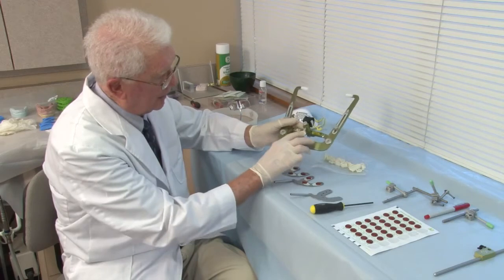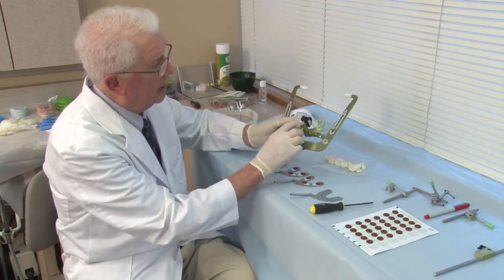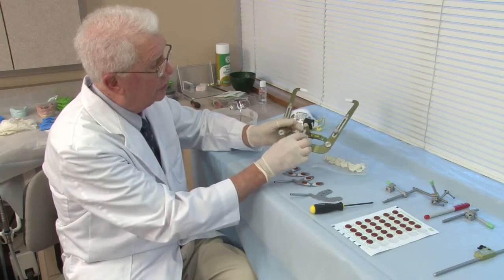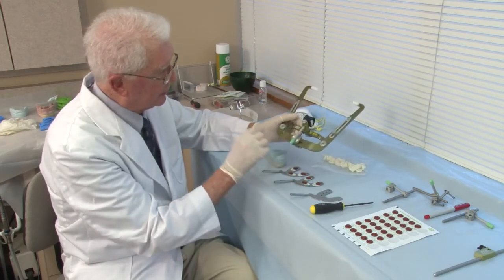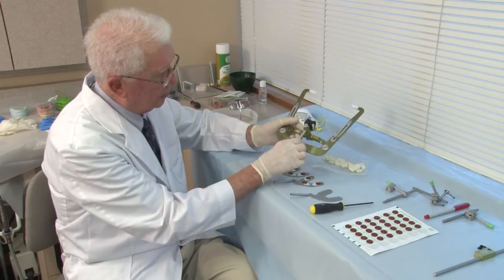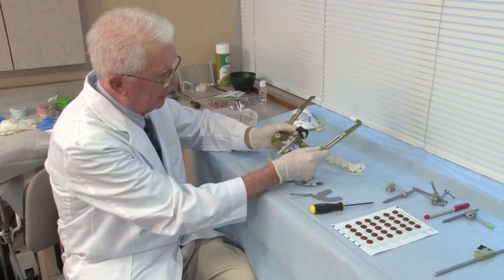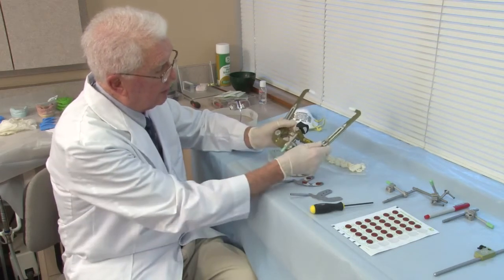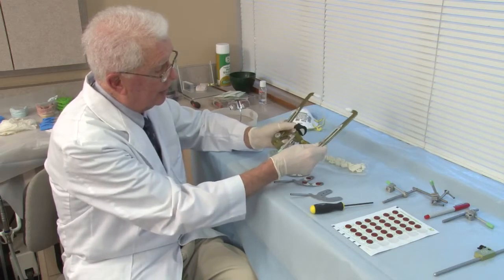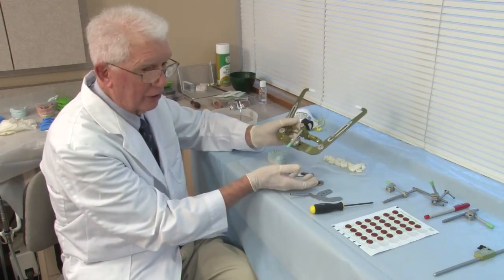Remember, the flat side of the Nasion relator has to be up so that this screw assembly will lock it in position against the flat side. This screw allows you to adjust the width of the ear bow. Be very careful. If you keep opening and closing, this screw gets looser and looser and it will fall apart.